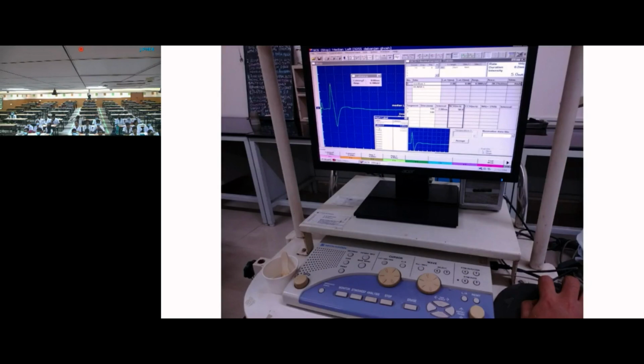Fine. So let us start with the sensory nerve conduction first. Let us take a median nerve. What is the course of the median nerve? It is mainly going to supply your forearm muscles, thenar muscles, and is going to give the sensory supply to your hand region and to the terminal phalanx on the dorsal surface. So what we are trying to do is find the nerve conduction study of the median nerve here. This is the example for you.